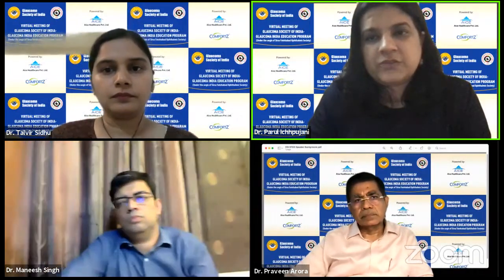So we have a question from Dr. Aparajita Lohan, and she asks me, how do we say that the disc is small or large on a fundus photo, not on a slit lamp? Well, on a fundus photo, you definitely cannot say, because you need to have a proper measurement. And the fundus photos can definitely be manipulated, zoomed in, zoomed out. So that's not a reliable way to say. You can always use a slit lamp or a direct ophthalmoscope. And with experience, I think you will just learn by yourself which would be a smaller or a larger disc.